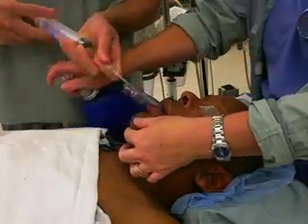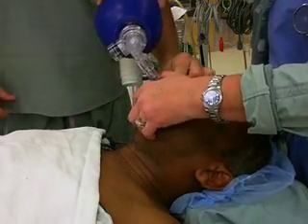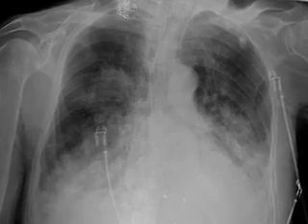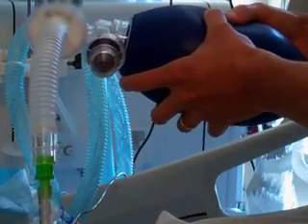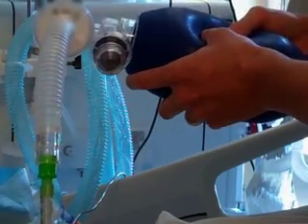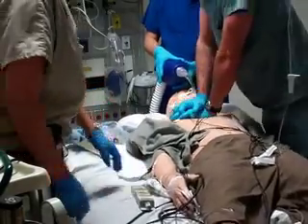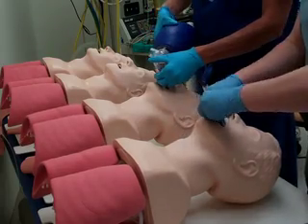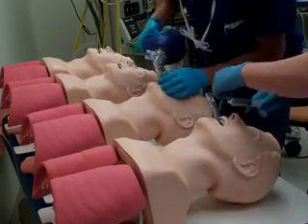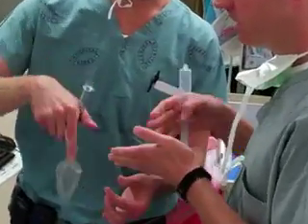Despite its numerous advantages for rescue ventilation, the laryngeal mask airway does not provide a secure airway and will not protect against aspiration when the volume of gastric contents is large. It may also be difficult to ventilate a patient with laryngeal mask airway when high airway or thoracic pressures are encountered, for example during vigorous chest compressions, or in obese patients, or patients with parenchymal lung disease. Additional familiarity with the laryngeal mask airway can be gained with practice on a training head model, on a patient simulator, or on real patients in the operating room under the guidance of an anesthesiologist.